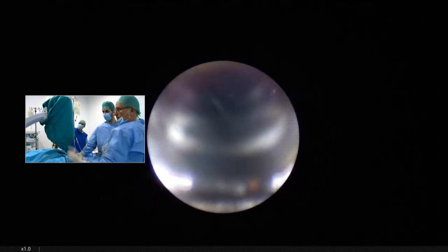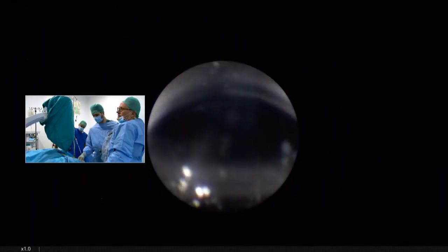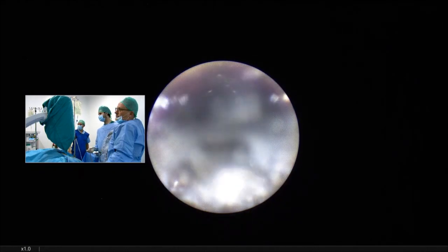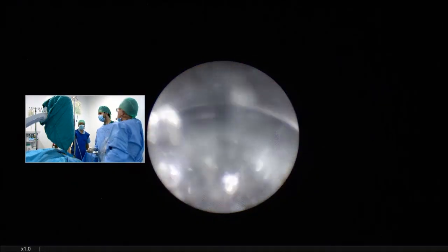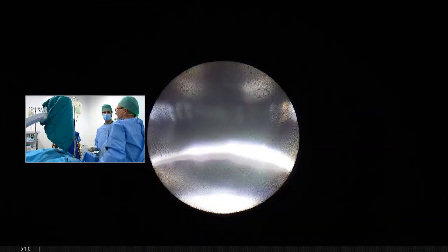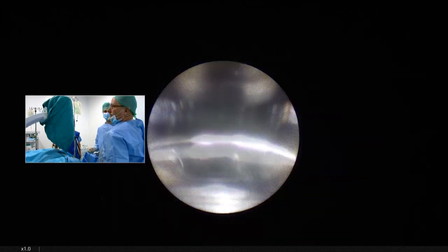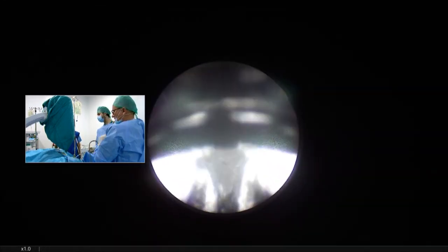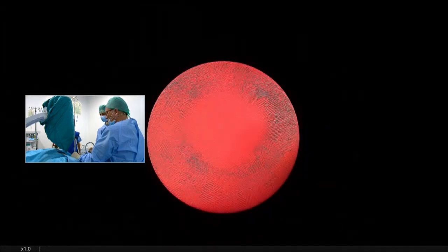Now X-ray. Satisfied? Okay. Yes, we see that there is no remaining stone. Okay, I think we have removed the whole stone now.